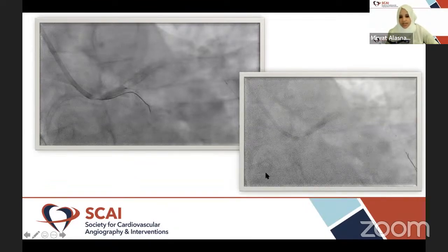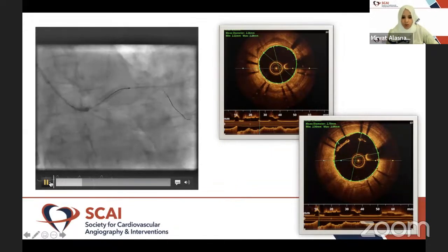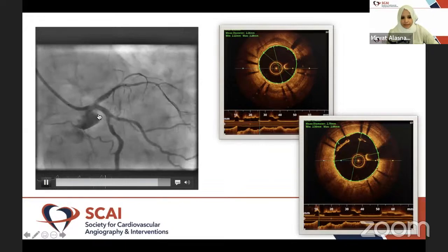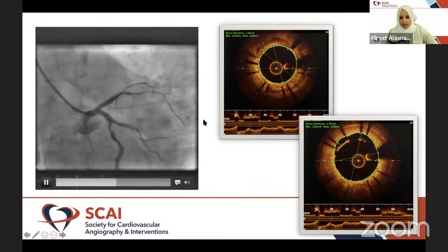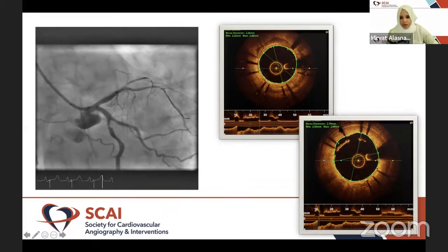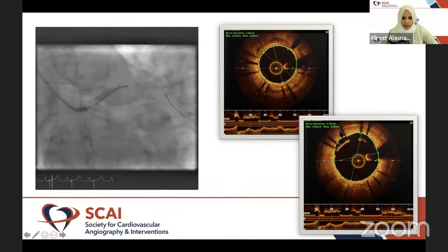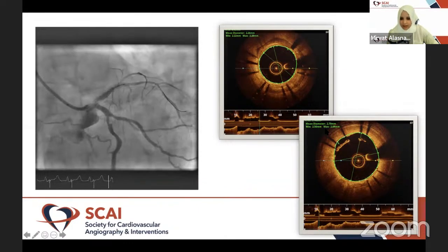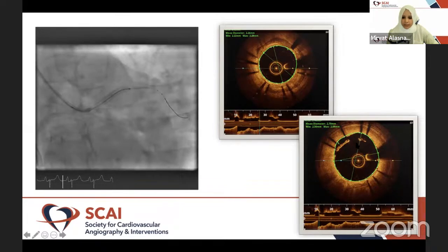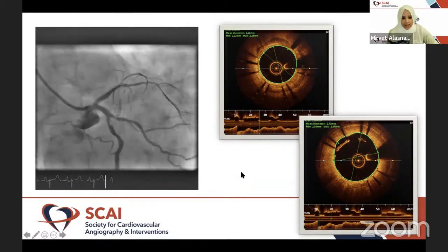So we did post-dilatation of the stent, more proximal optimization, and then went ahead and rewired that circumflex and ended up doing more OCT imaging. So this was the OCT imaging again, post-stenting, and you can see that now we have a well-expanded post-stent. I don't think we were well calibrated, so I don't believe this is the correct size of the stents that you see here in green. But you do see well-apposed and expanded stent in the left main and in the LAD.